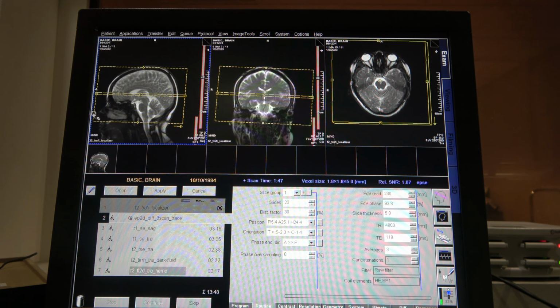So we got the nose. If the nose was outside a little bit, so something like this, this nose will come out on this side of the image. So we're gonna make sure we get all that here. All right, everything looks pretty lined up here, and that's because the patient is well set up. And here we go, all we hit is apply.